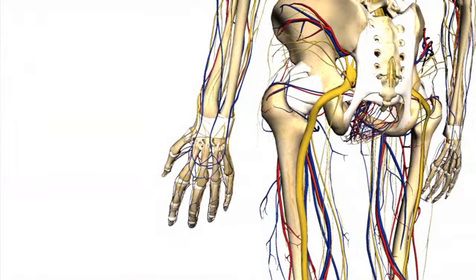In the preferred veins described here, most of the nerves are situated clear of the cannulation sites, but care should always be taken when performing the procedure. Now you can begin with the procedure for venous cannulation.